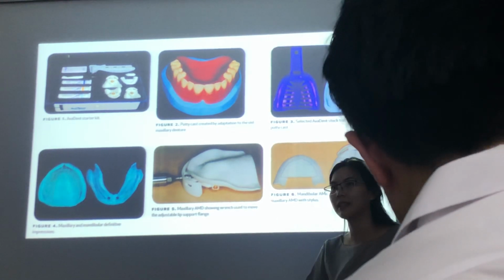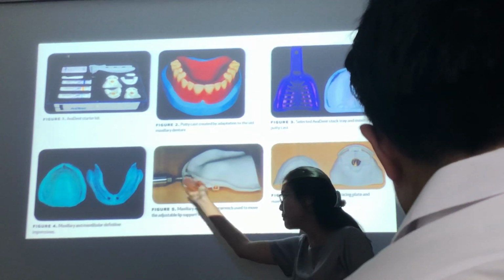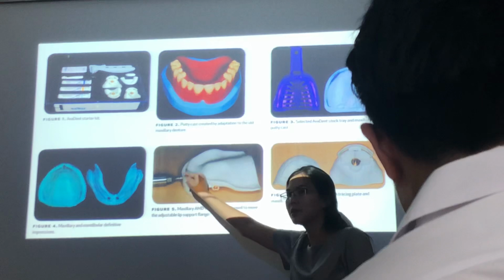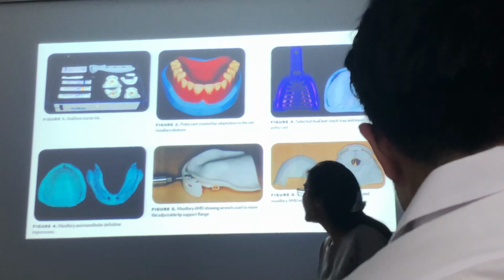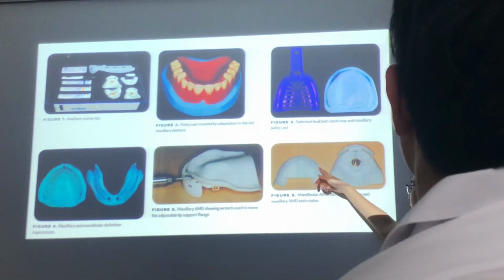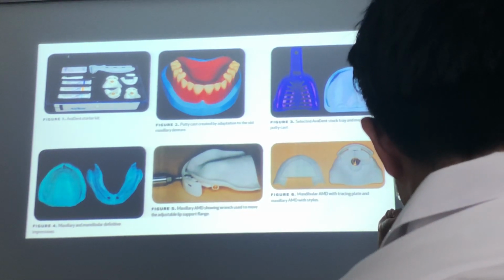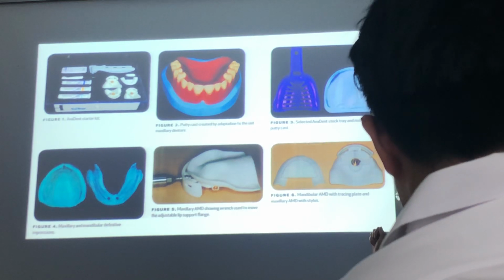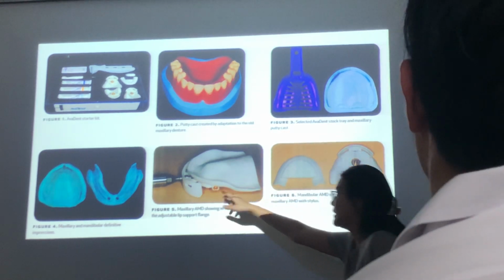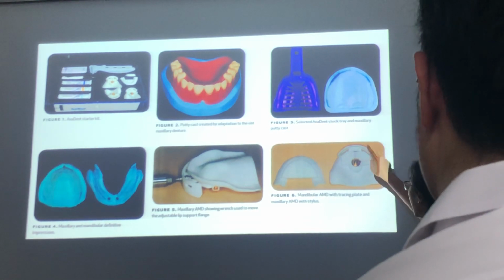It's like in the phantom head, but it's not wax. It's just plastic, and you unscrew and remove. Then when you get the proper contour, you just do the locking. And this is to register the CR position. Have you learned Gothic arch? No. Occlusion, you have learned it, it's okay. So this upper part is for adjusting the contour.